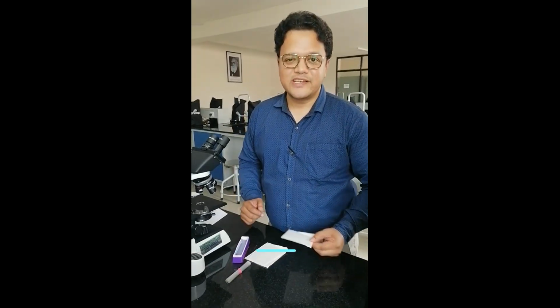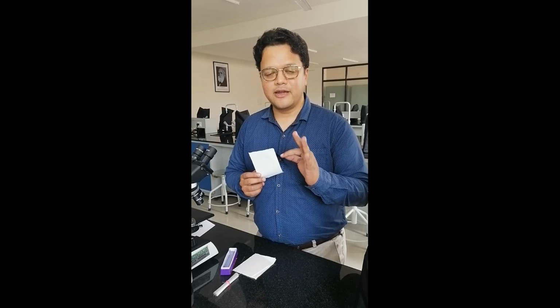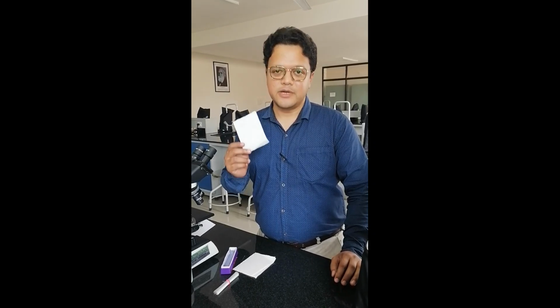Okay, so now let us see the next experiment, that is the bleeding time. So in this video I am going to cover three things: bleeding time, clotting time and blood grouping. So in bleeding time you have to know the method. The method we are using here is the Duke's method.